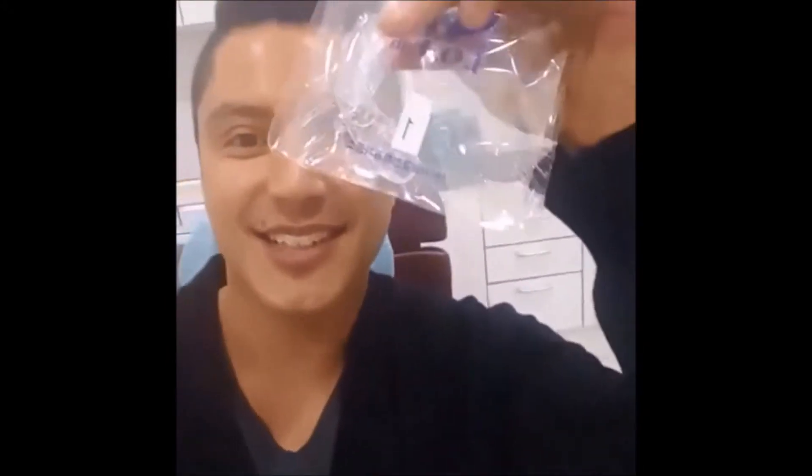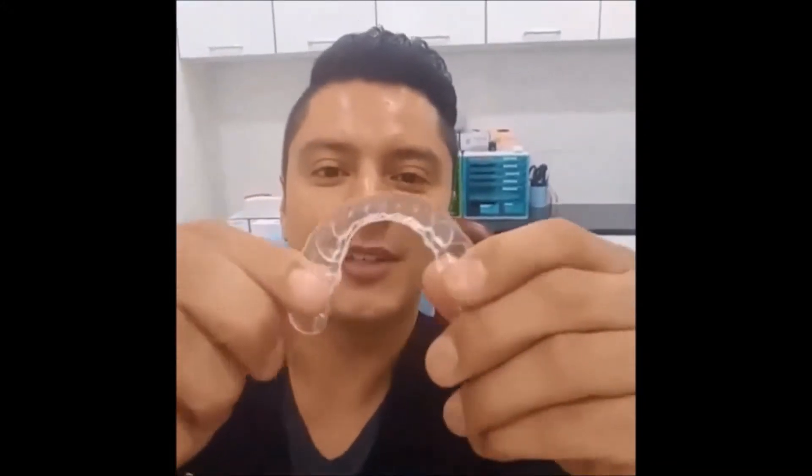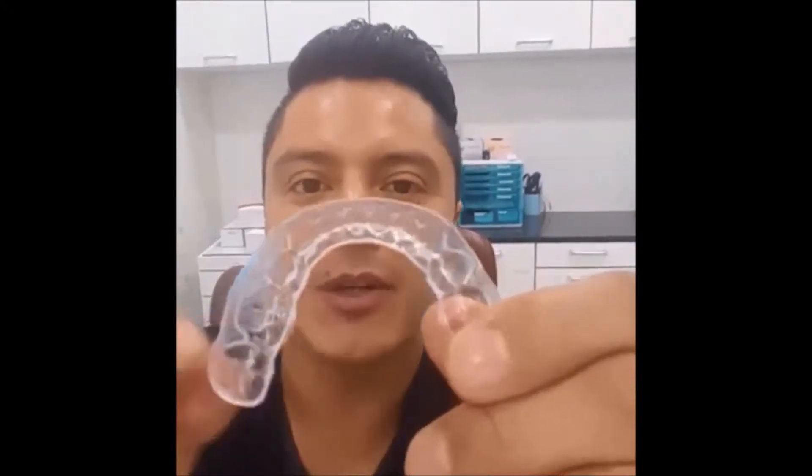Alright, so I'm going to start with my first appliance, number one. Let's see how it works. I'm really excited because I've wanted to move this tooth for a long time — this one here. So this is it. This is my clear aligner.